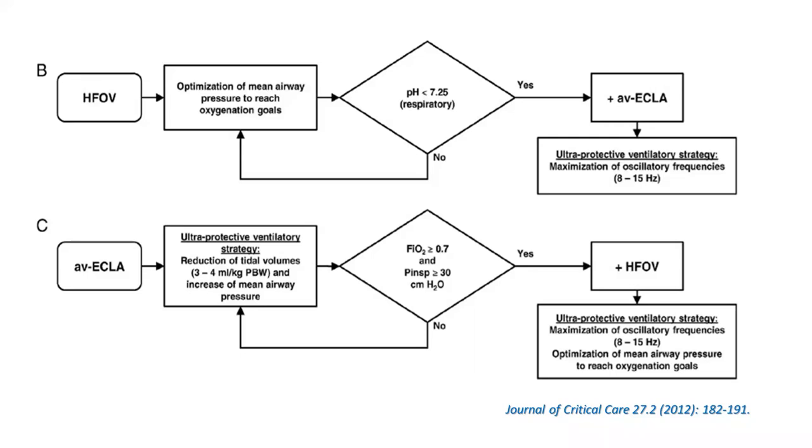However, in some situations of under-recruitment, the PVR will be high. That's one point. The other thing is that I utilize it as salvage: in case of mechanical ventilation, when I reach a certain parameter, then I go for high frequency at that stage. The only disadvantage of high frequency is that I cannot monitor the lung dynamics very well. With the conventional mode, I will know the compliance situation, also the resistance situation, and all of these answers.